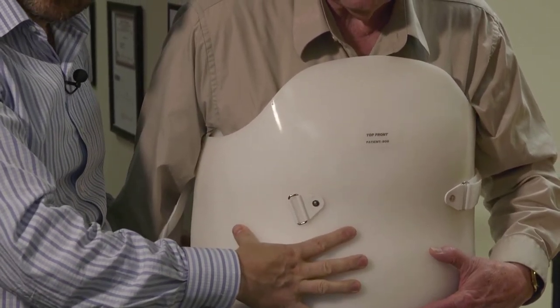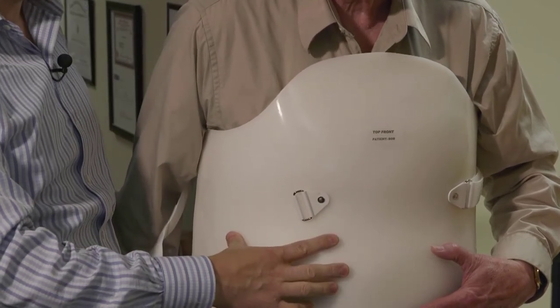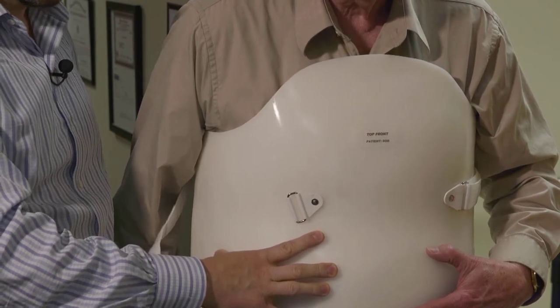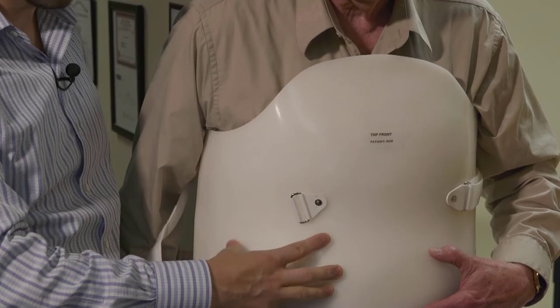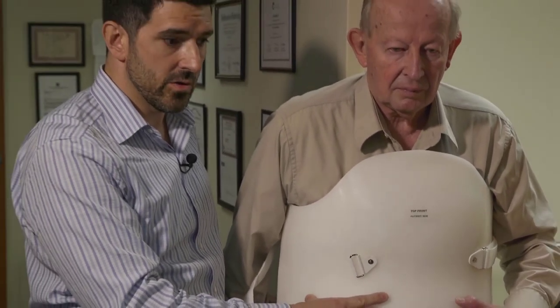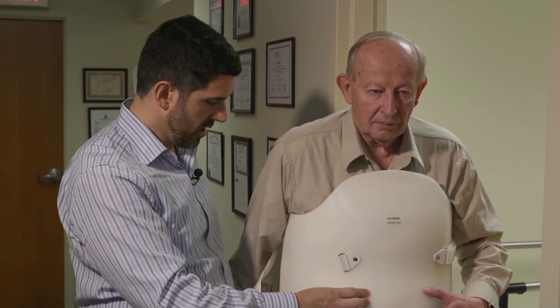It's not in his neck — he's straight. This is that X measurement I was talking about earlier, and it's really important for outcomes with patients because, after the brace is on, they begin their activities of daily living. We can either really help them, or if you don't take a few extra steps, sometimes they'll suffer.